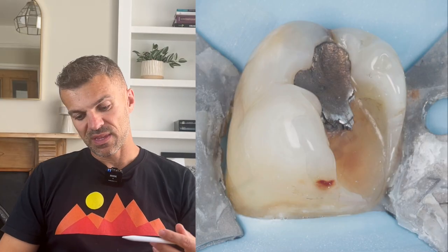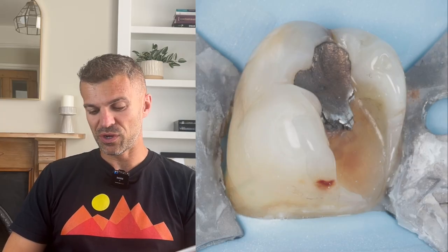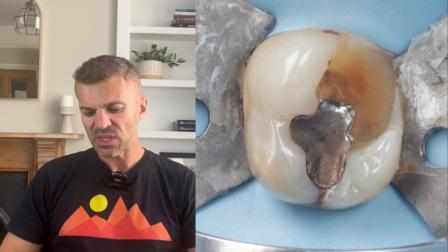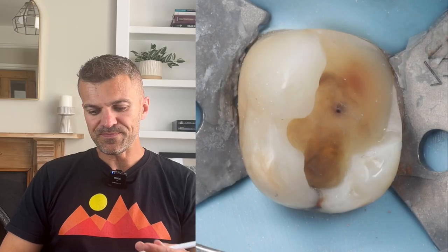I've done a few posts recently about rebuilding a cusp with composite and it's definitely been the topic I've had the most questions about, so I promised a few of you I would make a video on how to do this. If we have a look at a case like this, we've got your classic scenario of a medium-sized amalgam where we've lost that corner cusp. Sure you could fill this with an indirect restoration like an onlay, but equally this would work well with composite. When we clean it all up, this is our problem.